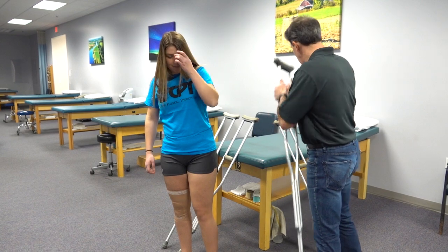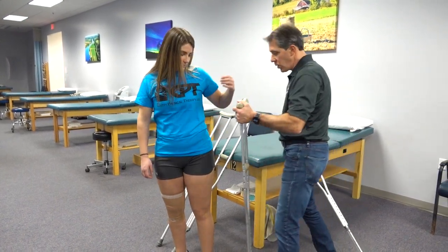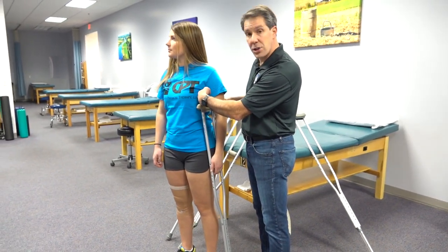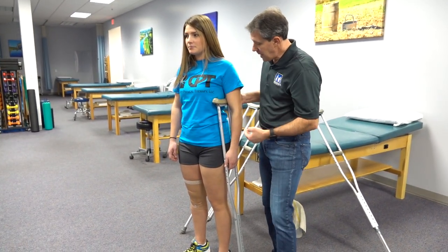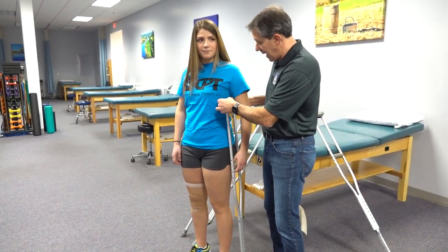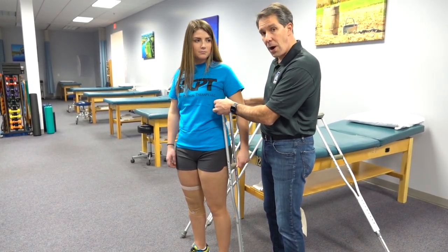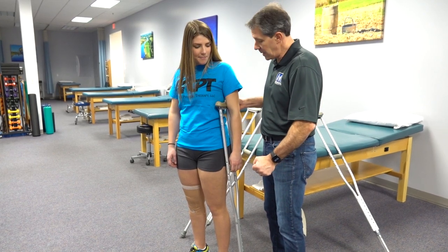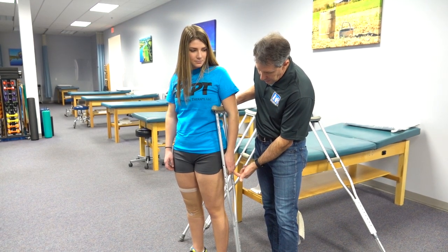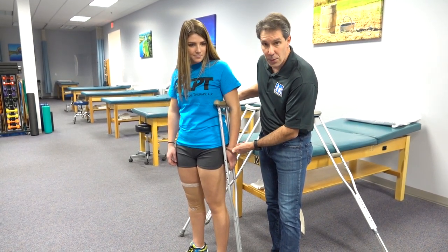Now I'll show you what a crutch that is too short looks like. As you can see, we have four to five fingers between the armpit and the top of the crutch, and therefore she's not going to have a lot of stability between the arm and her body — and it's important that you have some stability there. The other thing we notice is that the handle is down where her fingers are, and that handle really should be at the wrist.